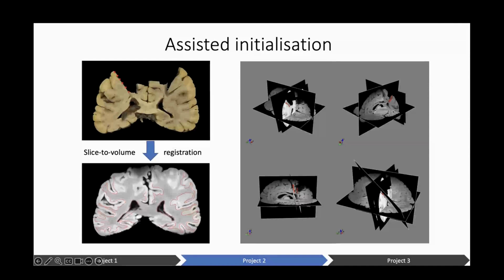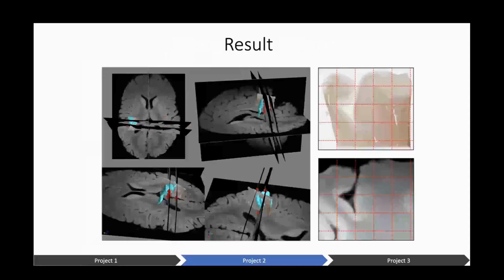And you can see that these edges were actually created by our previous sampling of the motor cortex. So what you can do here is to take 2 consecutive coronal sections on which you mark these edges, and then you register them using our 2D to 3D tool into MRI space. And that will take these annotations into MRI space. So you can see it on the right in reconstructed MRI space, the little red annotations. Those mark the outline of where the motor cortical block was sampled. And fitting a plane to that gives us an actually good idea where the histology section was sampled from. And we can initialize the histology section into that space and run the regular 2D to 3D optimization algorithm that we created to find the best position. And as you can see on the right, we can achieve a pretty decent registration between the histology and the MRI space here as well.